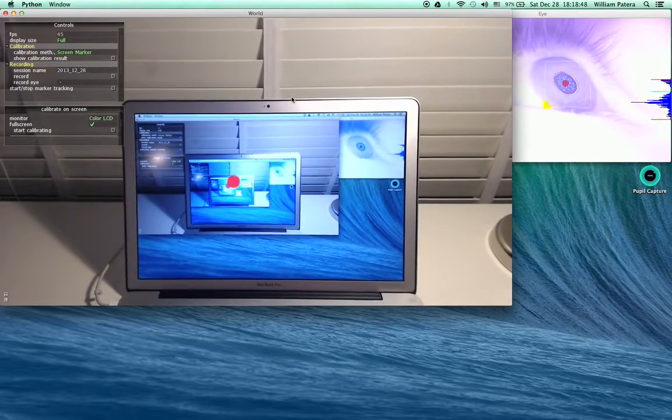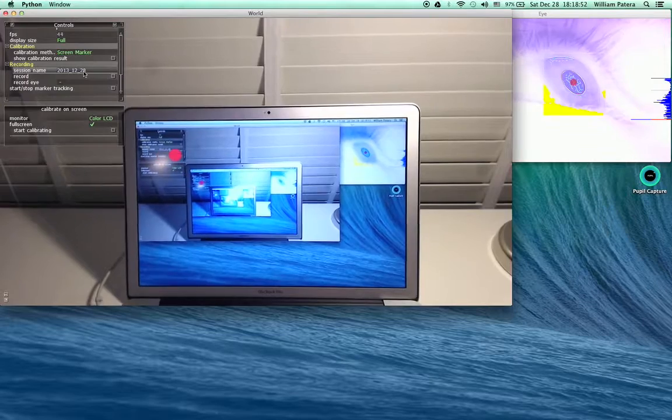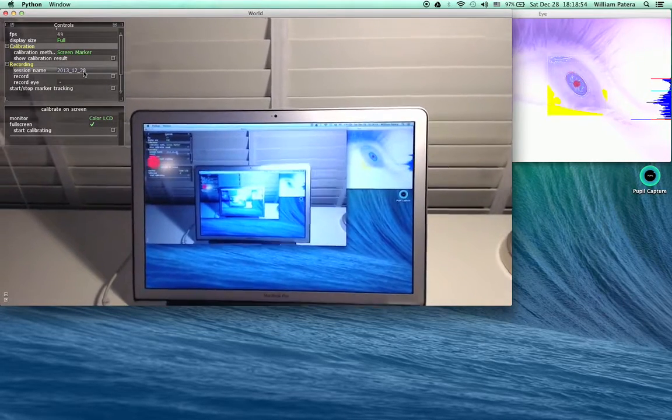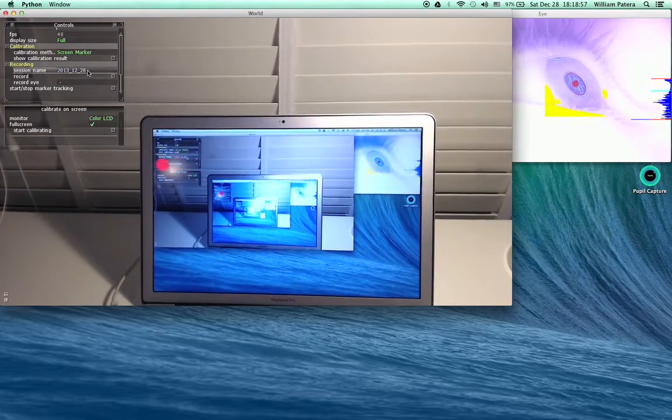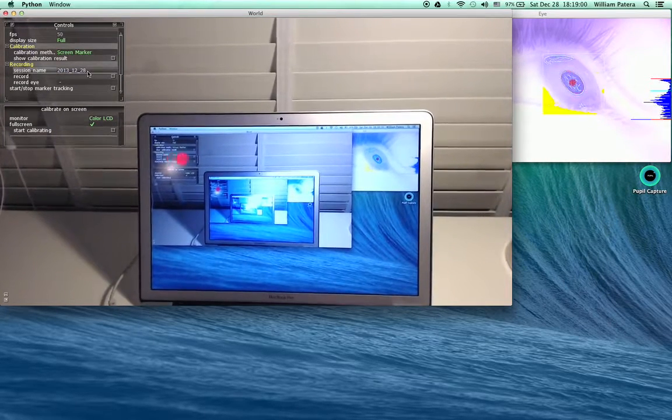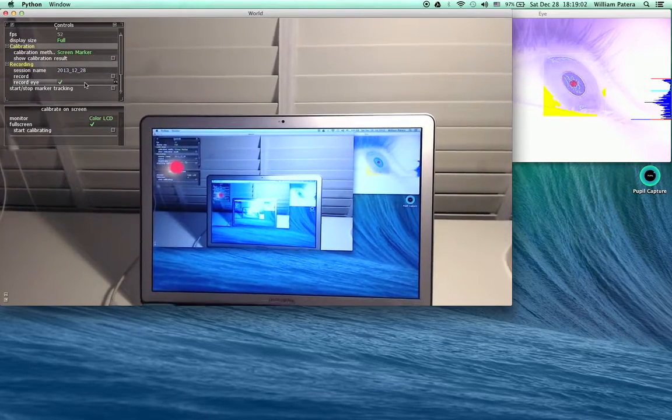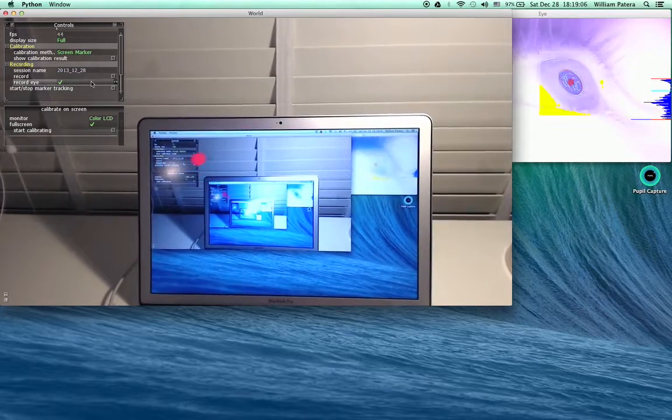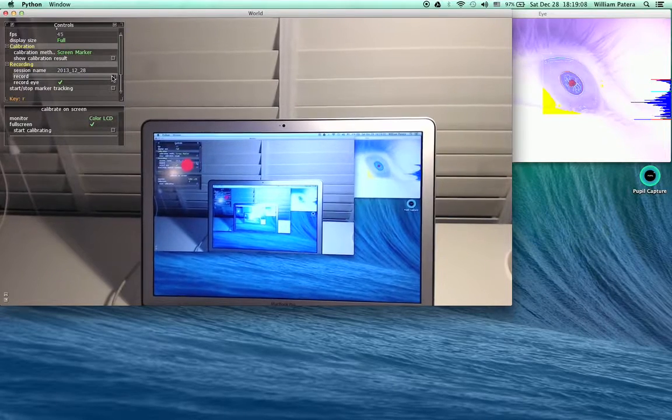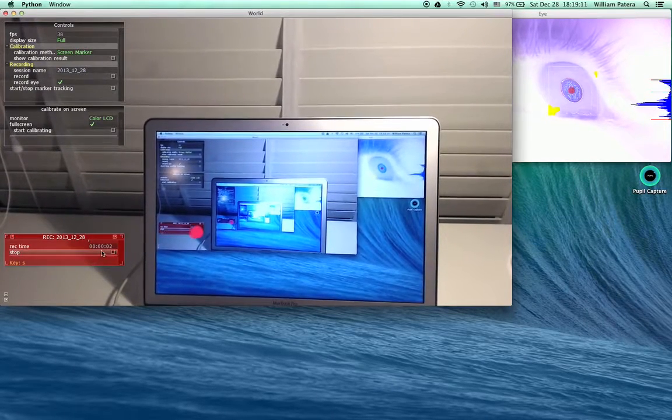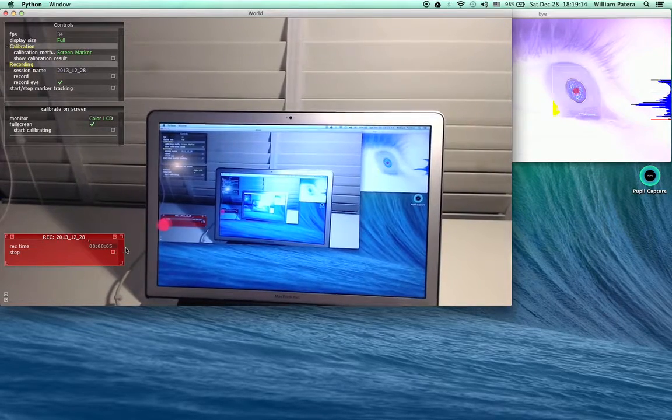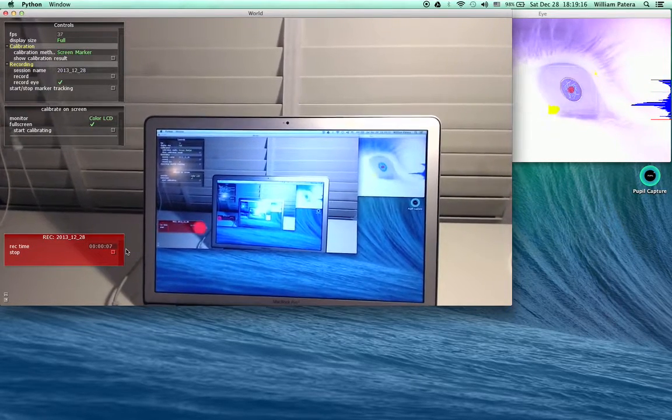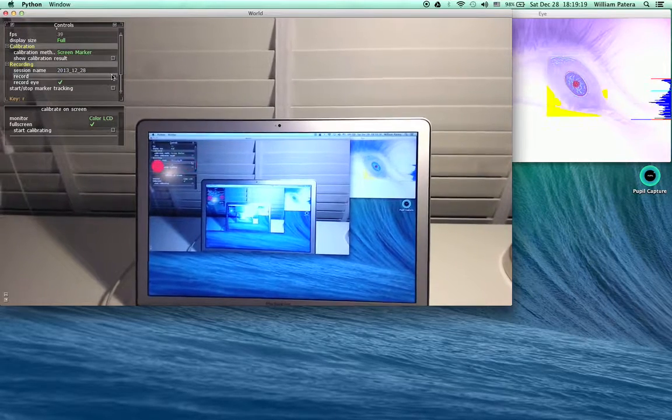The recording goes to the Recordings folder, and you can name sessions. By default, we name sessions by the current date. You can also choose to record the eye at the same time. To record, just click Record, and you'll see this red box pop up with elapsed time showing how much time you've spent recording.